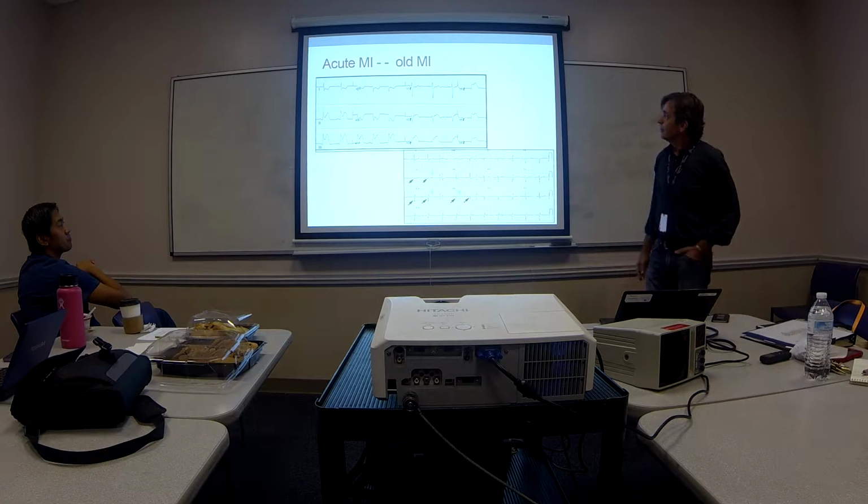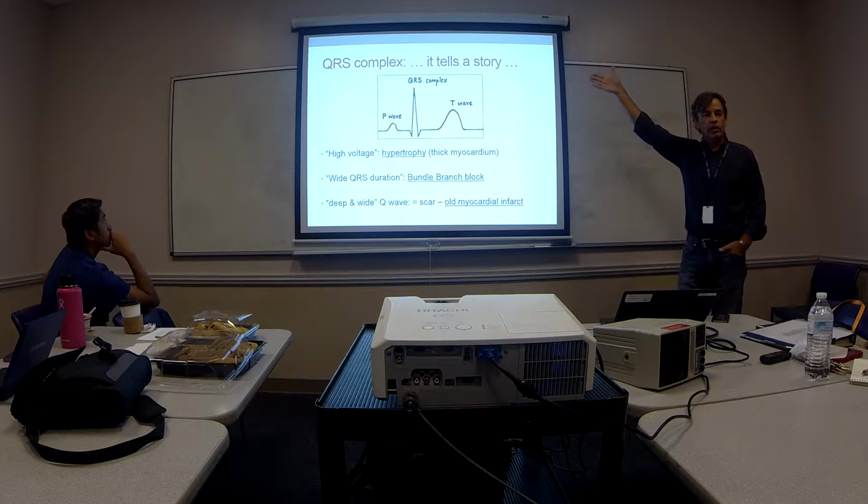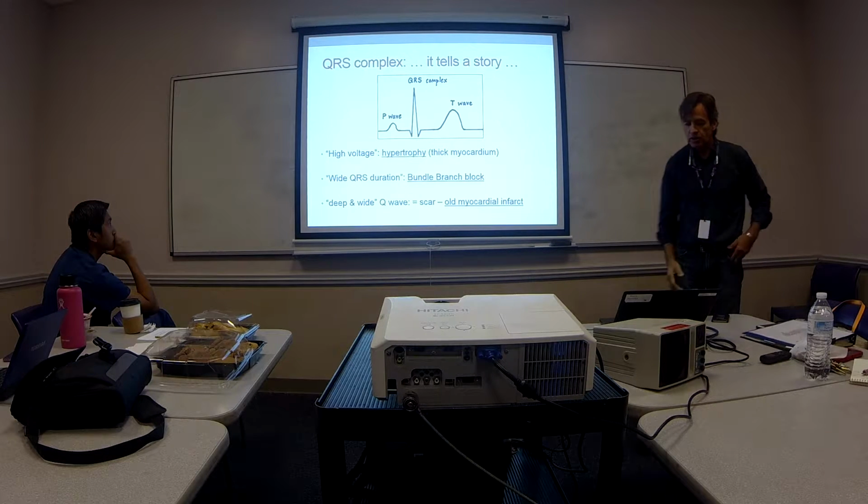So this would be sort of a tracing and so on. So the QRS complex tells you a story, and you put that into the patient's medical condition and history.